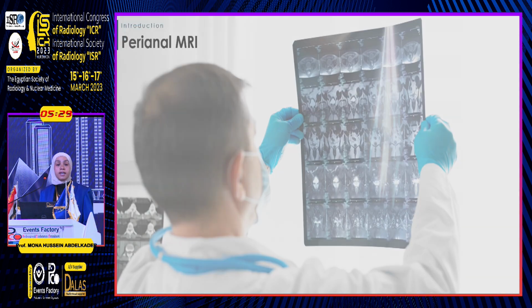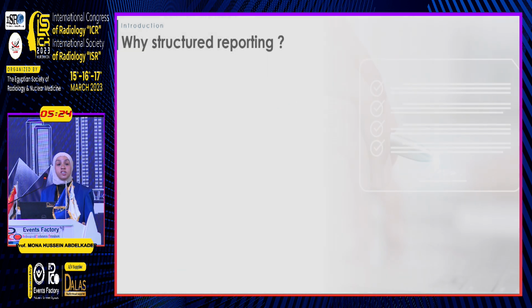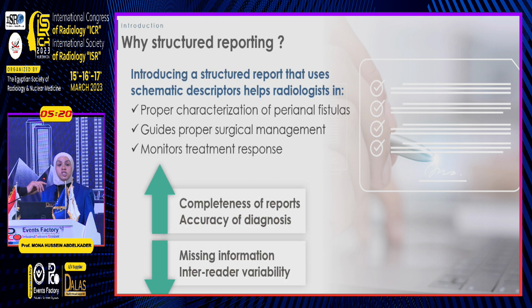As known, MRI is extremely helpful in diagnosing the perianal fistulas. The structured reporting is a simple template containing key descriptors which help proper characterization of the perianal fistulas, proper surgical management, and monitors treatment response. It aims to increase completeness of reports, decrease missing information, and interreader variabilities.